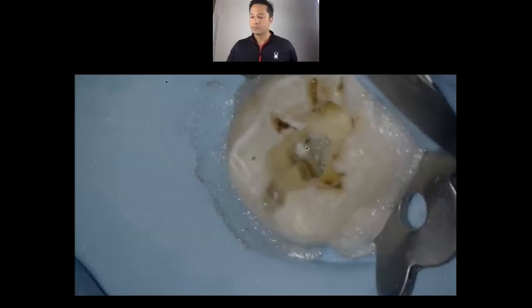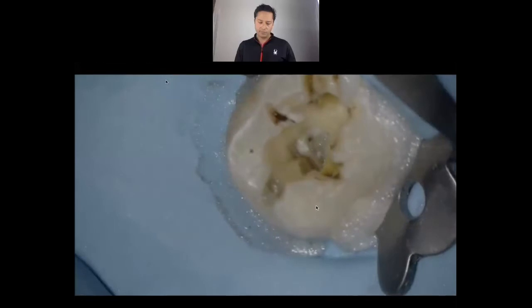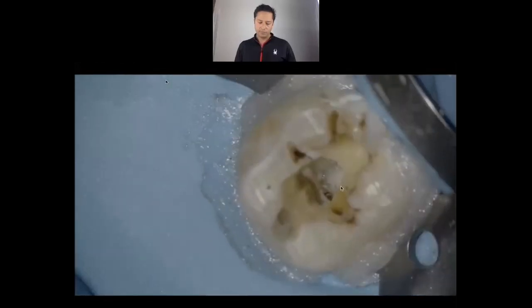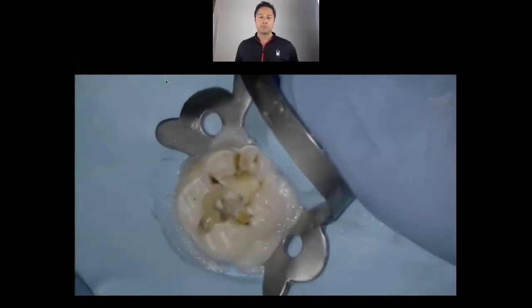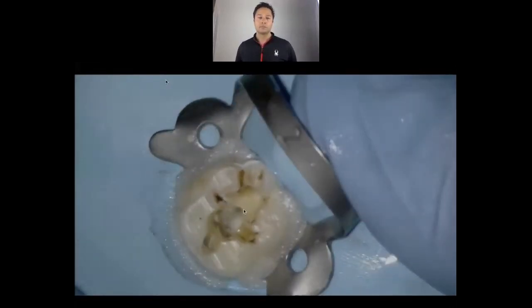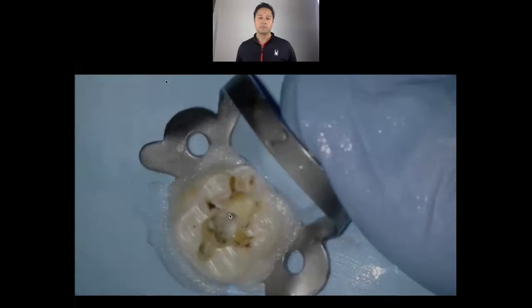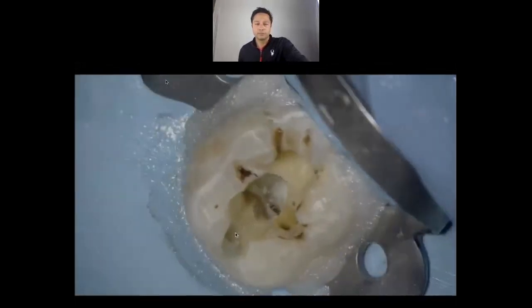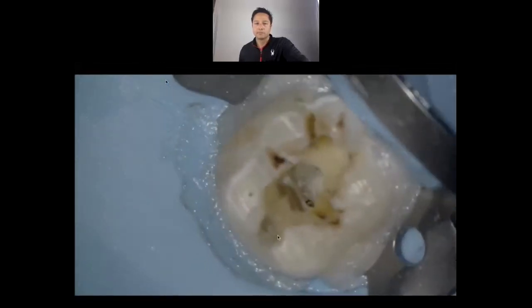This is the buccal of our tooth — this is our mesial buccal orifice, there's our mesial lingual. There's no lingual inclination to this extracted tooth, so it's not going to show you getting into the lingual canal. Then we'll be using our law of symmetry. Because I'm using high magnification and can angle the tooth any which way I want, I'm only going to make this access like this. But if I'm not sure, I'd make it more of a square — I have burned myself by missing a distal canal.